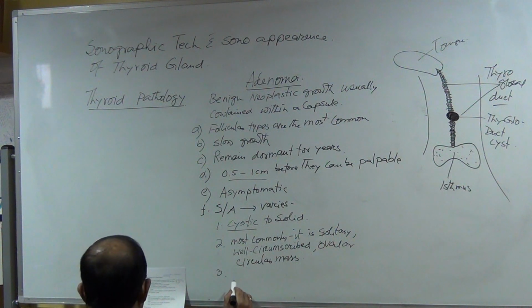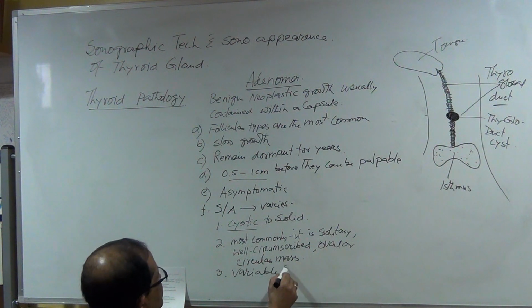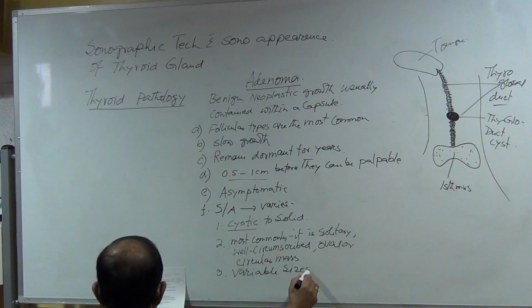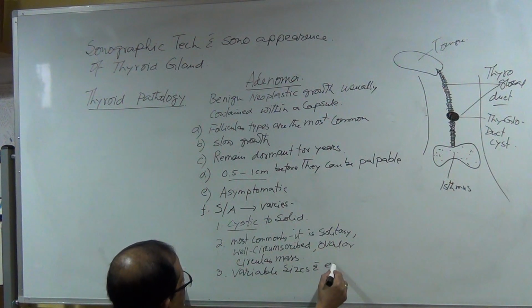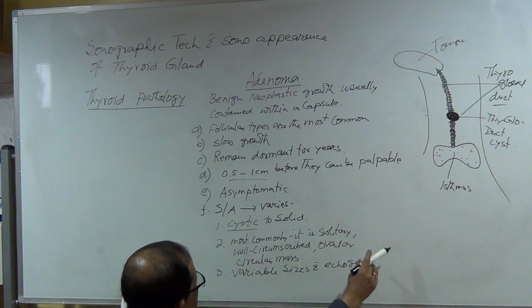And number 3, variable size and echogenicity.